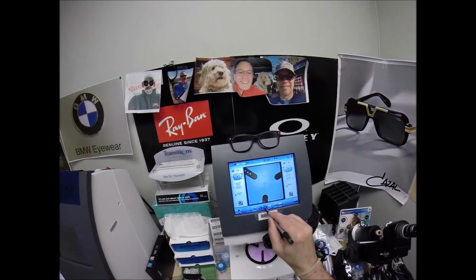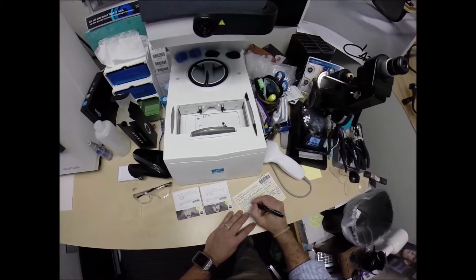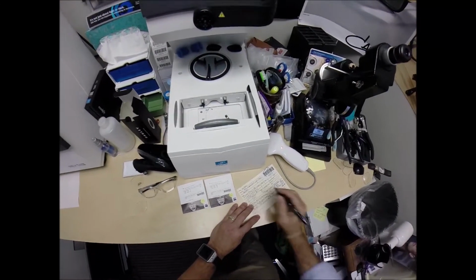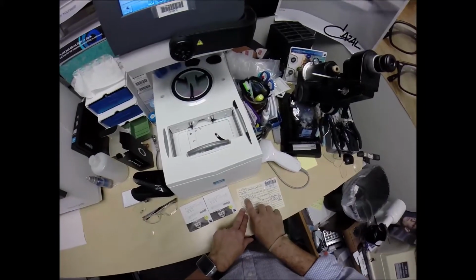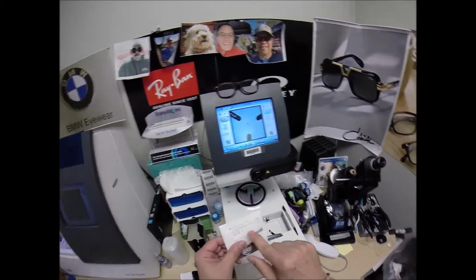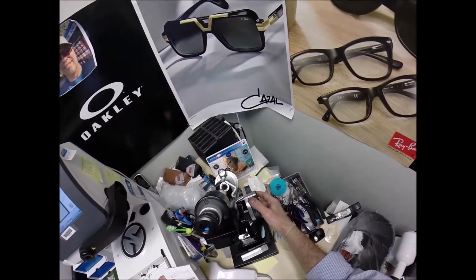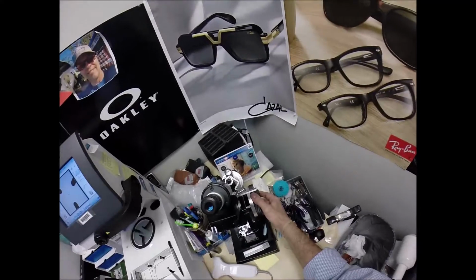I do want to raise the optical center height up 2 millimeters, and we're going to cut that at 22. I'm going to go 2 above center, 22 millimeters. That's for my own permanent record. Now your right eye reads -1/4, -1/4 at 2. Let's make sure everything's on 0, laser it in, put it on -1/4.